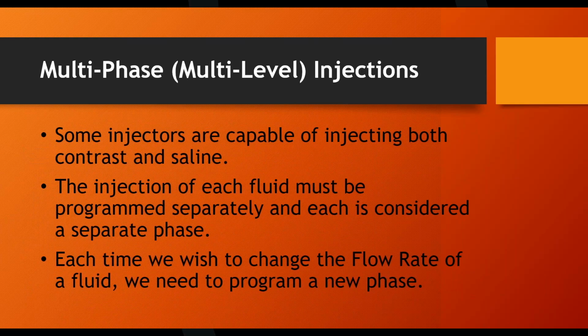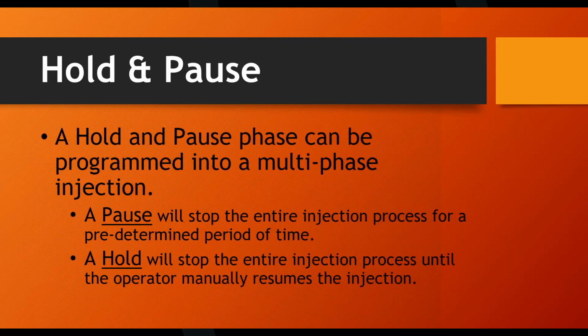Sometimes, yep. All right, holding a pause. Now hold and a pause seem like they're the same thing, but there is a difference between a hold and a pause.